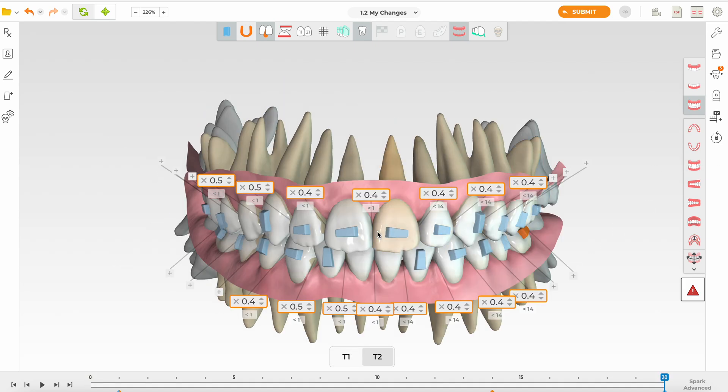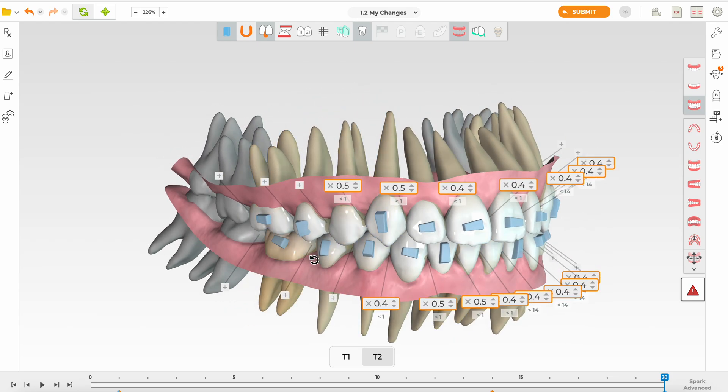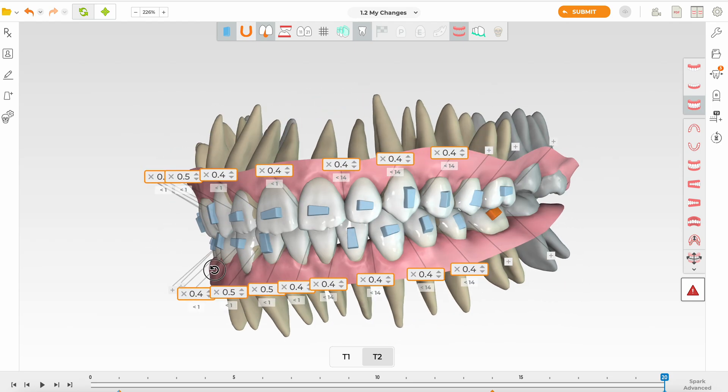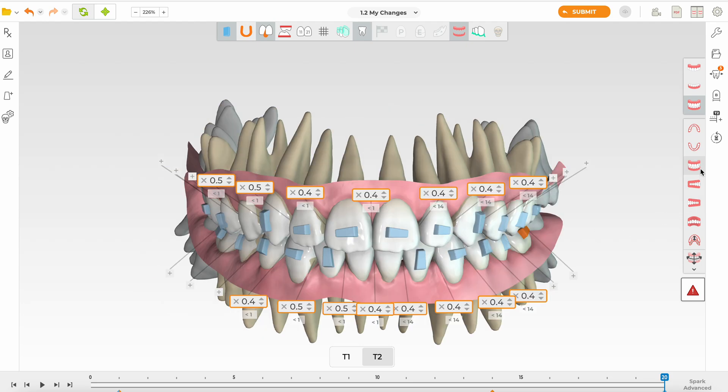I also change all the beveled attachments to my horizontal or vertical conventionals. It's something I recommend. In fact, studies show the bigger the bar, the more the moment of the force. So I prefer to use my larger conventional attachments over the tiny beveled ones and optimized ones that I personally think don't work. I've done several cases where I don't really like them enough to change them to my conventional vertical and horizontals.